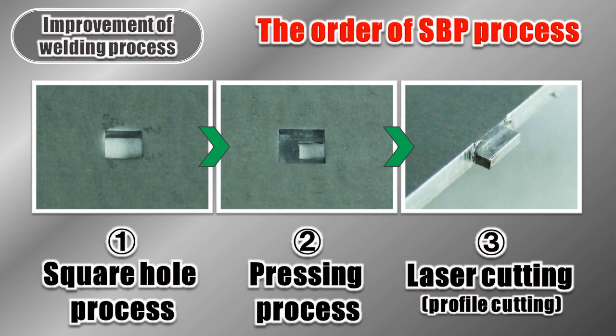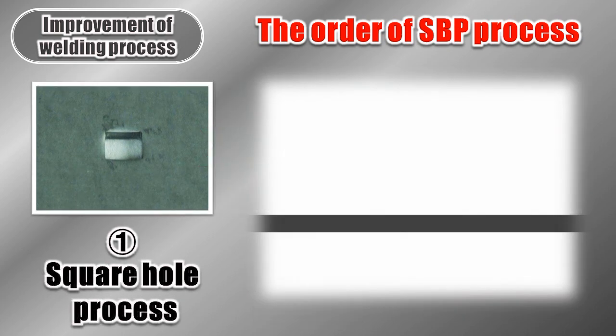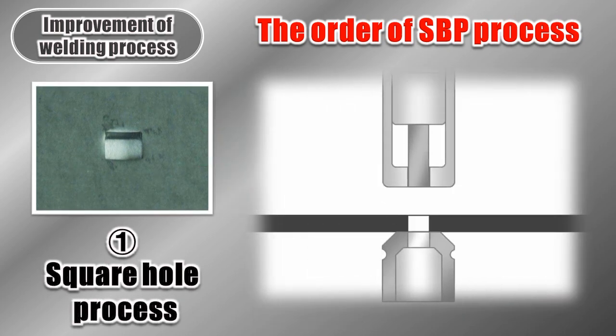Tabs and slots are made during the blanking process. They are processed in 3 steps, in this order: 1. Square hole processing, 2. Pressing, and 3. Laser cutting. The first step is making a square hole.